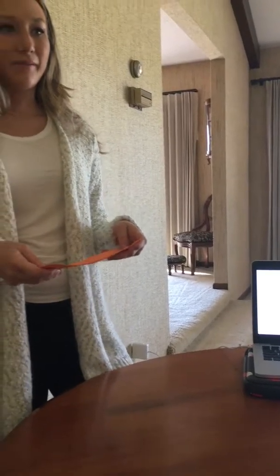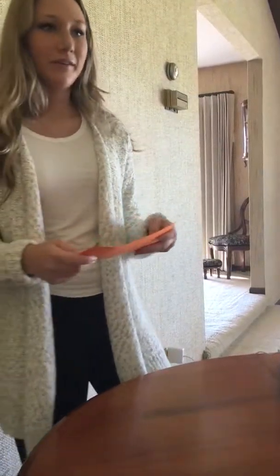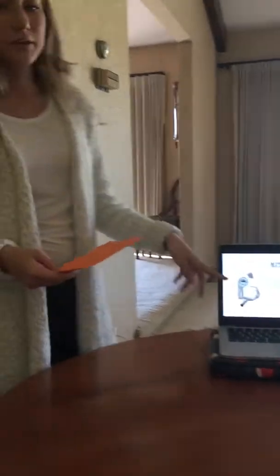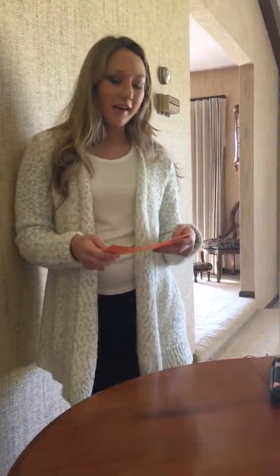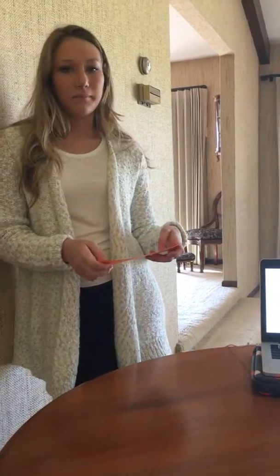Today I'm going to tell you guys about paralleling and film techniques. There are some materials that you need when taking dental x-rays with film. There's the PID, which is the machine you can see on your handout, and then the bite tabs and bite blocks. Bite tabs are used when taking bite wings, and then bite blocks are used when taking PAs.